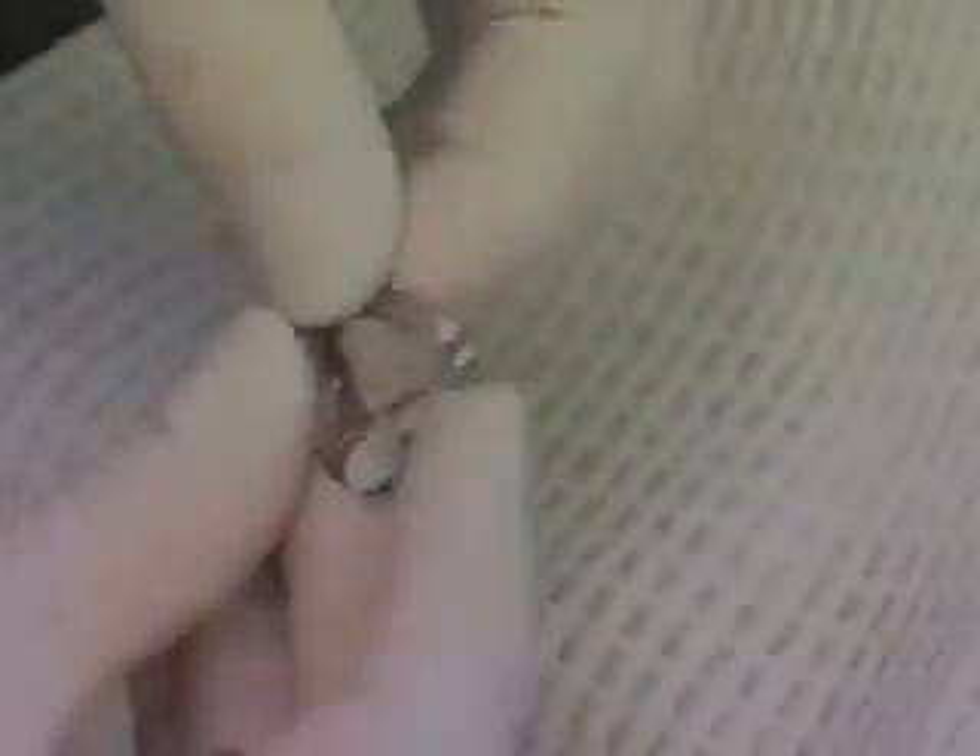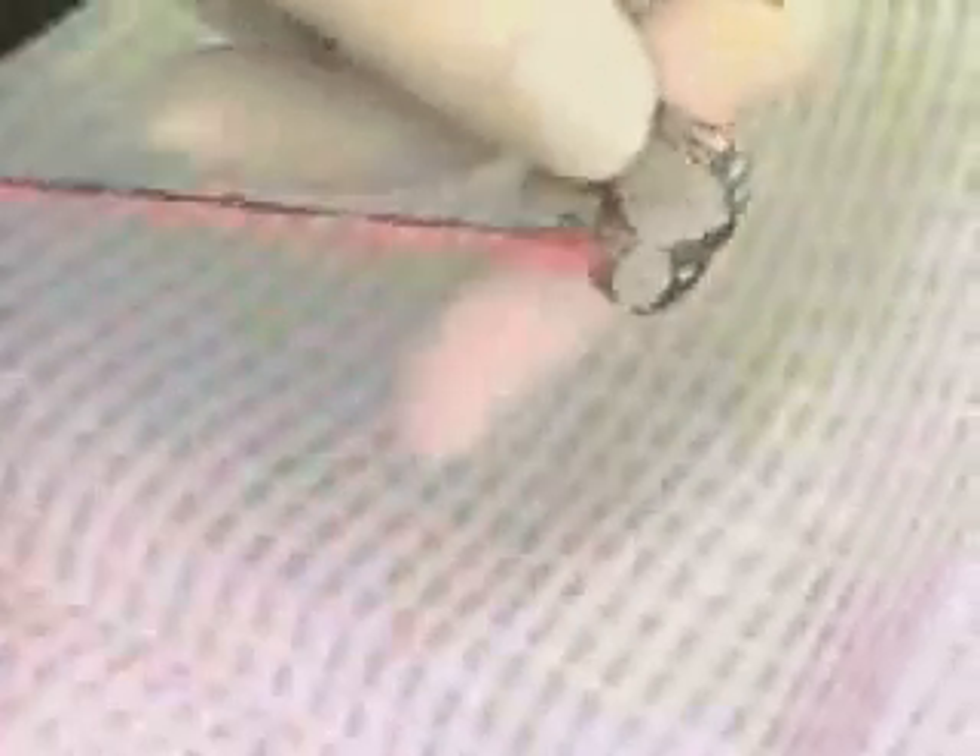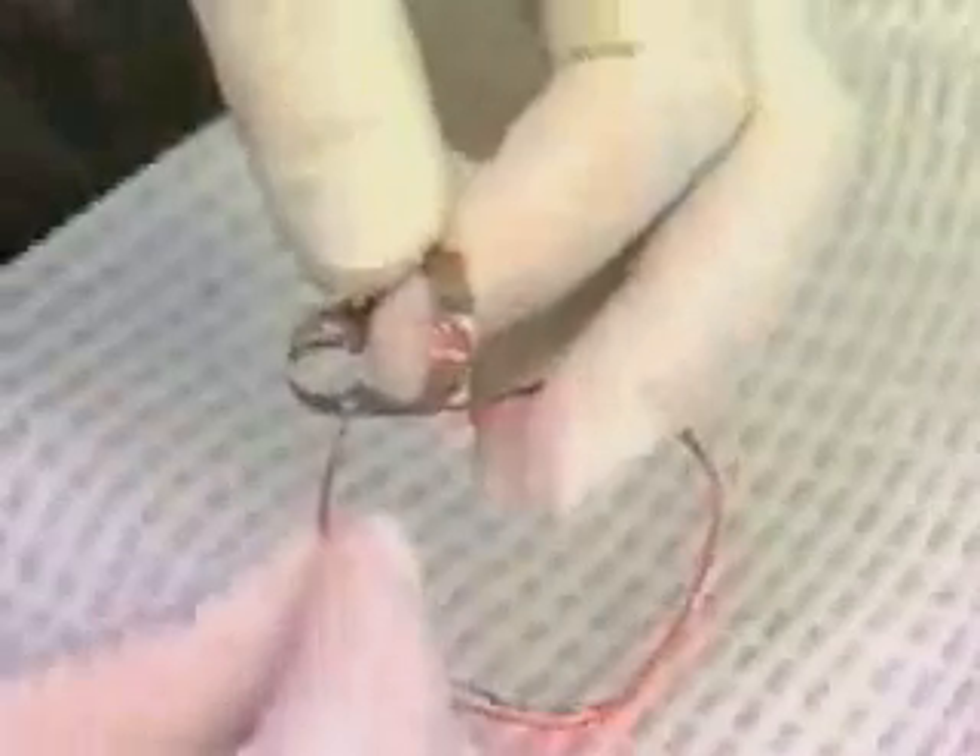Once you have selected the proper clamp, secure a sufficiently long piece of floss to both sides of the clamp. A minimum of 6 to 8 inches of floss should hang from the clamp when it is properly secured. The floss acts as a retrieval mechanism if the clamp should slip from the tooth or break apart and obstruct a patient's airway. It is imperative that both sides of the clamp are secured with floss, as in the event of clamp breakage in the mouth, either side of the clamp could cause an airway obstruction in the patient.